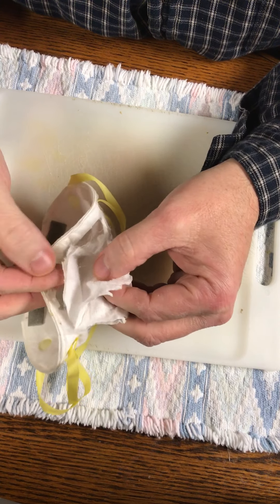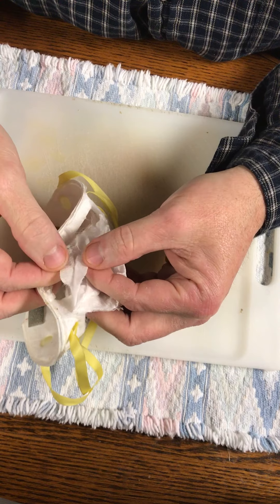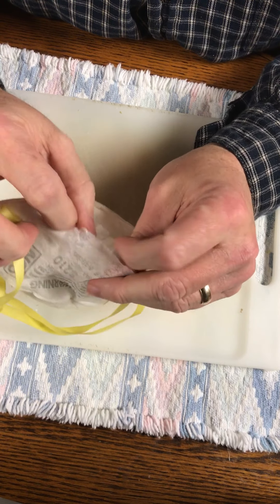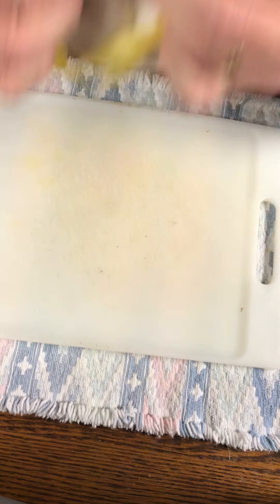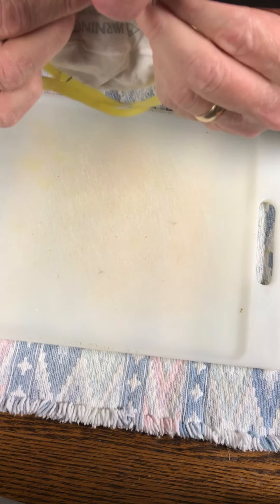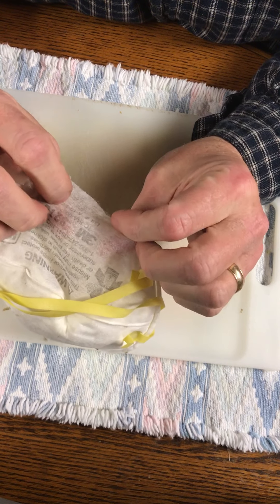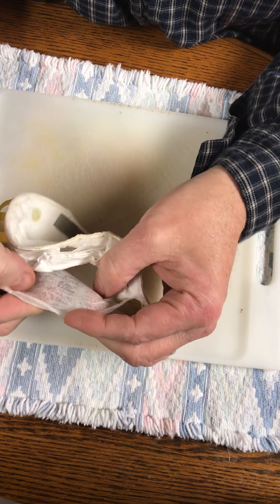So there's really kind of three layers: that one layer, the second layer, and then the outside layer is really thin - I mean there's like no resistance when you blow through it.